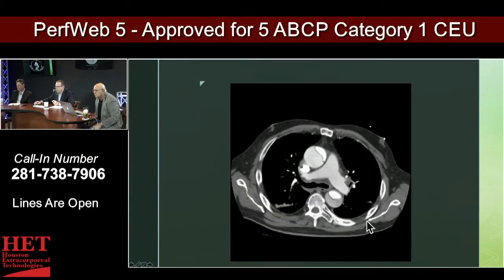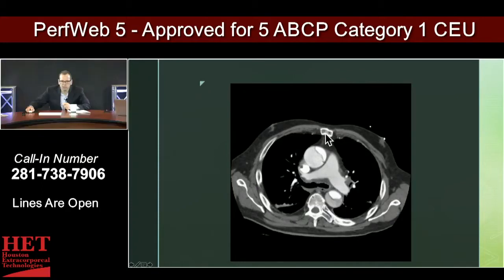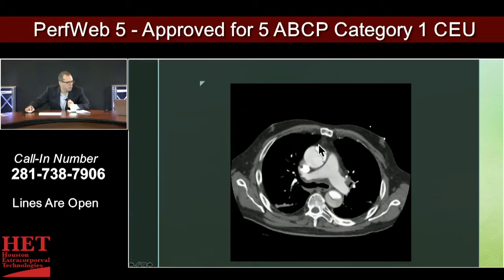This is going to be the scapula — outside the chest cavity. Anteriorly you have the pectoralis here and breast tissue. This is going to be the sternum. Directly beneath the sternum we have the anterior mediastinum. So if you have a patient with a mediastinal mass, this is where you're going to see it — a thymoma, a thyroid malignancy, a teratoma, or even a lot of lymphomas will show up in this area as well.